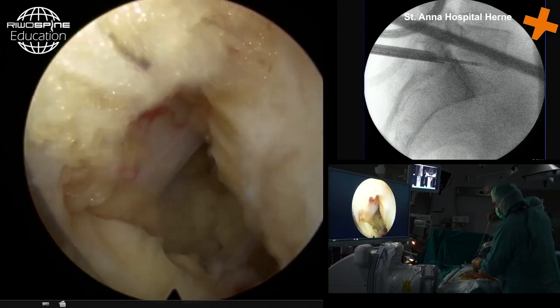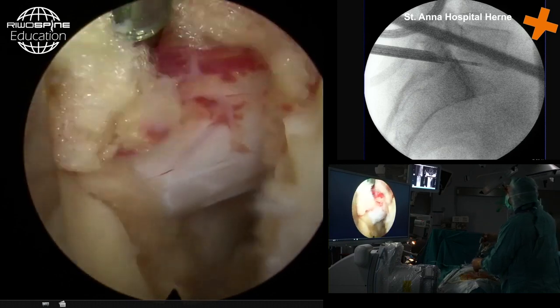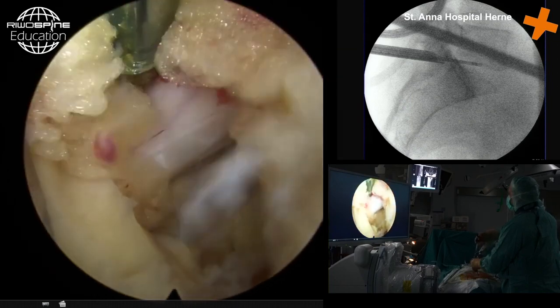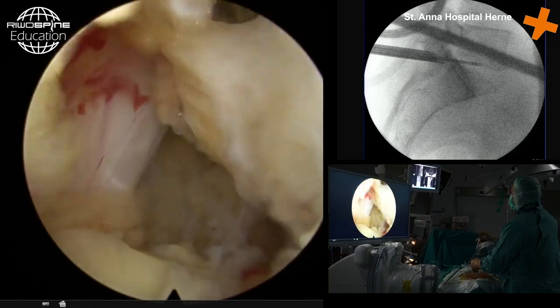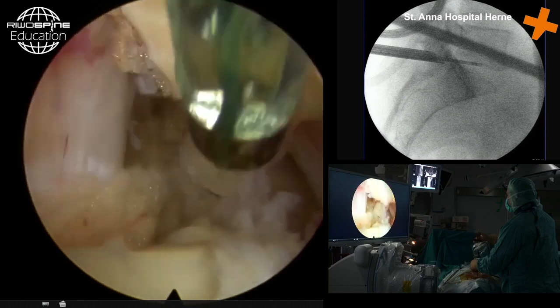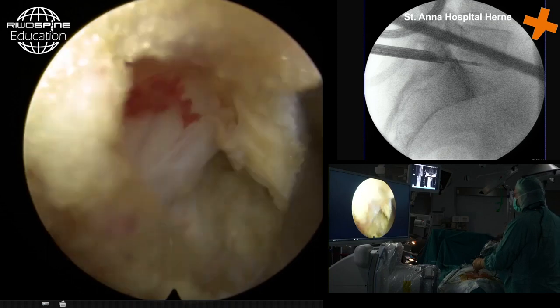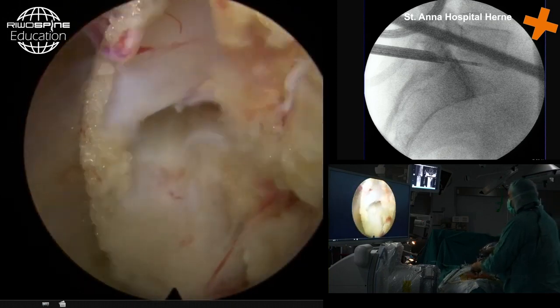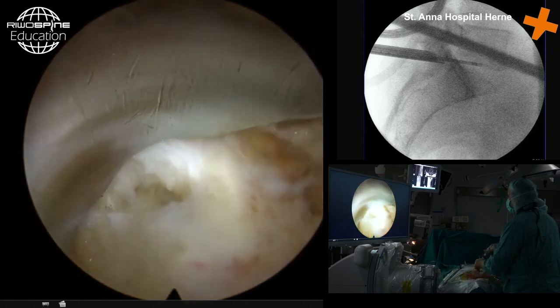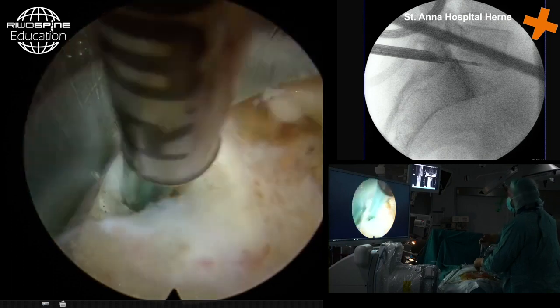So just here again an overview about the anatomy. Medially we have the starting of the axilla here. That's the S1 nerve root, caudal, cranial, and here lateral, the joint, medial margin of the ascending facet. Here's the disc space, and when we again rotate the cannula, we medialize the structures. We can medialize the cannula until we find the defect where the herniation went through. And here's the entry to the disc space.